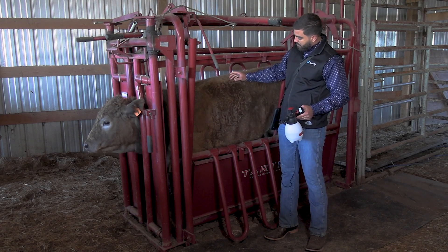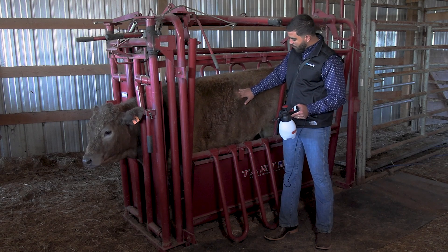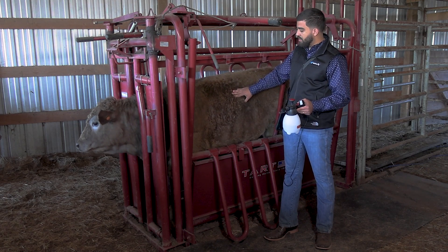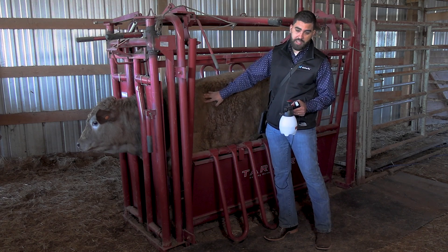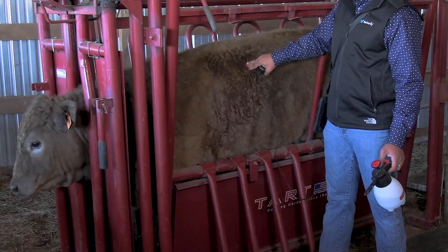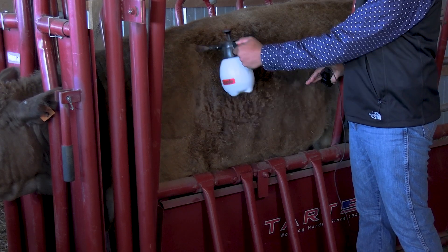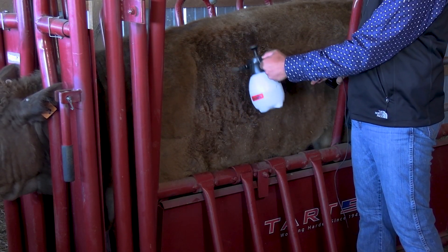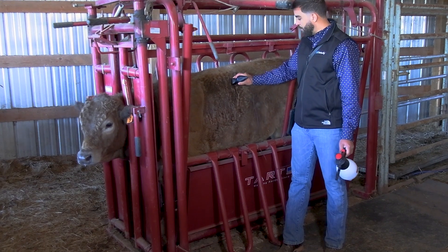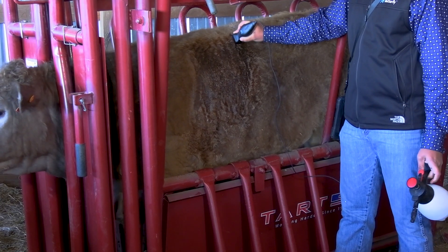On a bovine, the lungs are quite pointy up here. This is the caudal dorsal area, so we palpate the last rib, which is the 13th rib, and we want to be scanning every single intercostal space from the caudal area all the way to the 9th or 8th intercostal space. You palpate and place your probe on the last intercostal space. Make sure you have plenty of contact, then go dorsally.